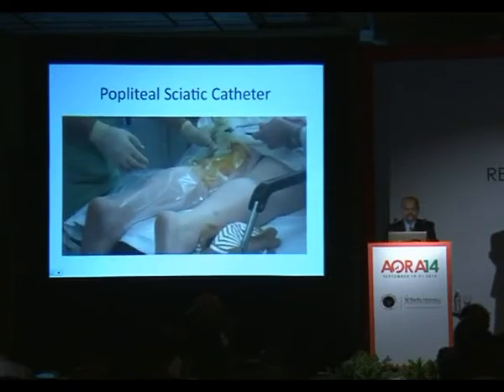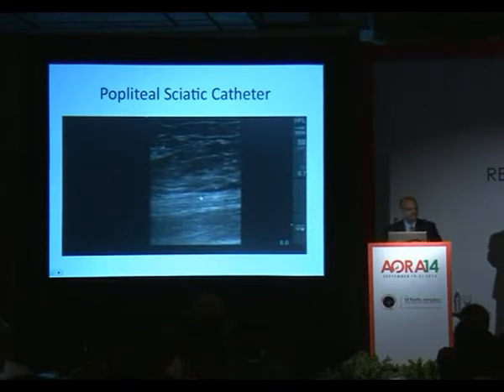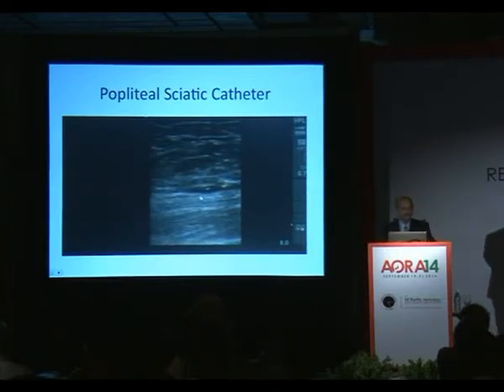And as you inject your local anesthetic, you abolish your twitch response, and you can actually see the spread of the local anesthetic solution. Now, in interest of time, I'm just going to skip ahead.